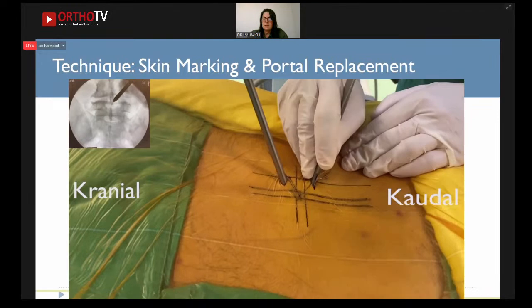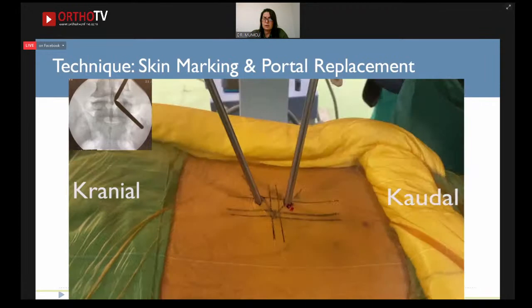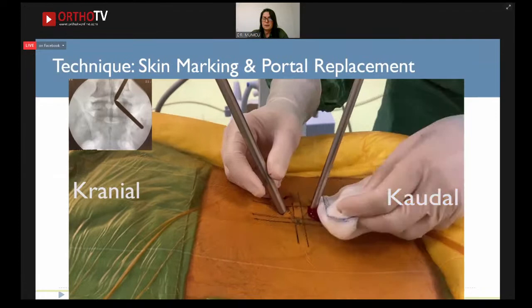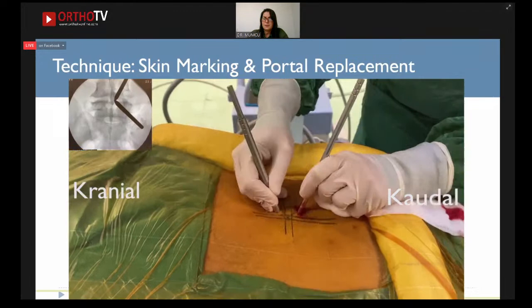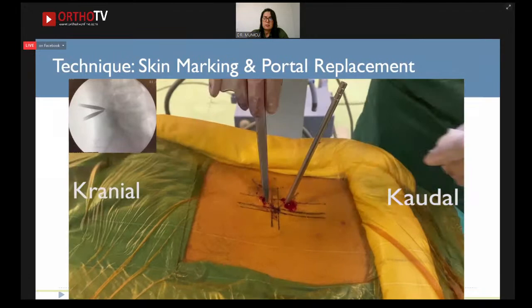It is necessary to prepare enough visual space. At the end, the scope and RF probe are inserted through the incisions, then create a V-shape working mode on the upper lamina. Finally, potential space is made with RF. Triangulation is crucial. If you make good triangulation, you can see the instrument on the screen. If you don't, that makes the surgery difficult.